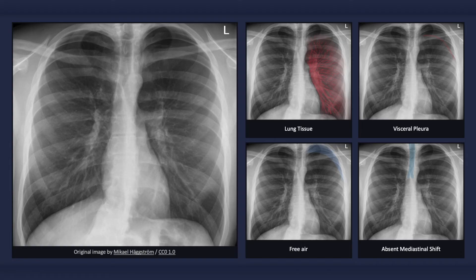Although most x-rays are taken in the upright position — where air collects superiorly and laterally — unfortunately not all patients can stand. So when the radiograph is taken with the patient in the supine position, air actually collects basally. This may seem counterintuitive, but in that position, the anterior and lateral costophrenic sulci are actually the highest points in which free pleural air can collect.